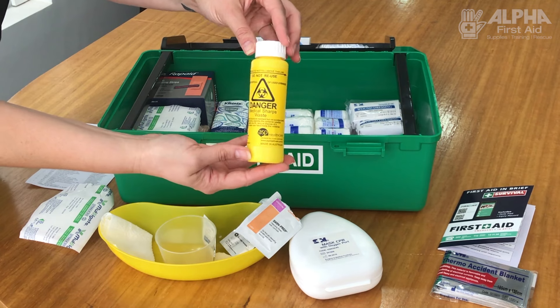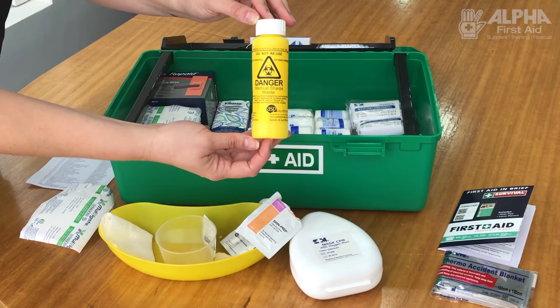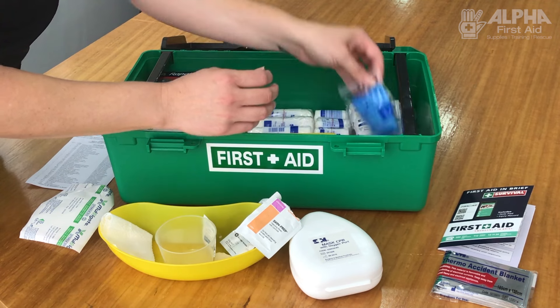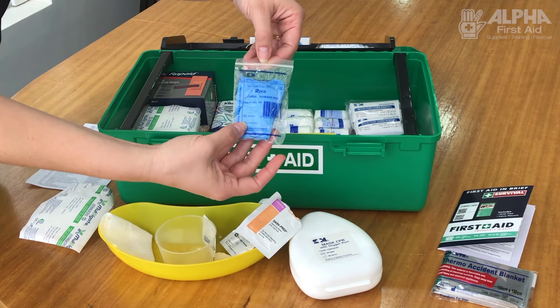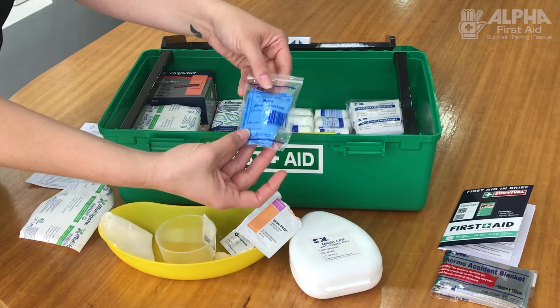Any sharps — your splinter probes, or if you're in an environment where there are needles — go into this sharps disposal kit. The most important thing when you first start doing any dressings is to put on your gloves. These ones are nitrile gloves, which means that anyone with an allergy to latex can still use them.